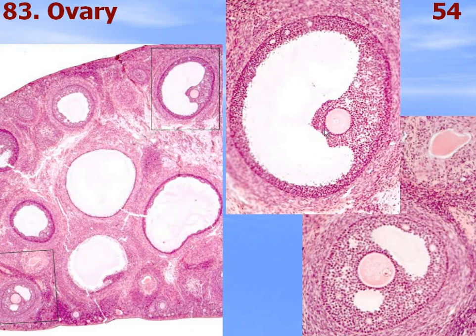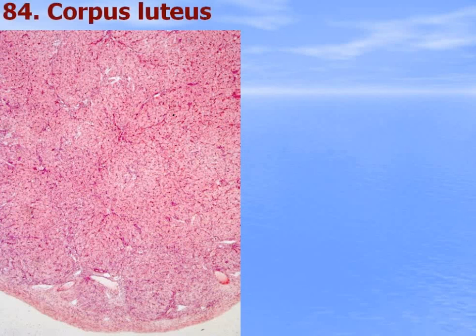The tertiary follicle shows the cumulus oophorus with the oocyte, granulosa layer around the cavity filled with follicular fluid containing estrogens, basal membrane, and teca inner and outer layers. Corpus luteum is a temporary endocrine gland — this is a corpus luteum of pregnancy, a very large gland inside the ovary.